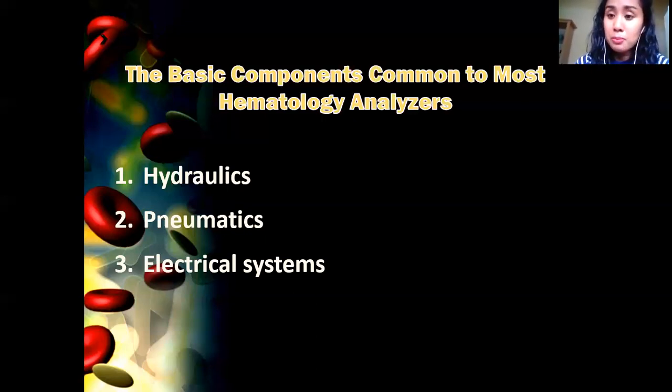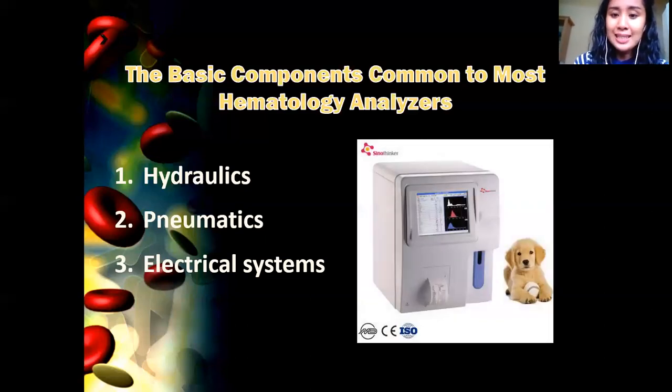So, as much as possible you have to know the tubes, ganyan, or you have to know kung may bara, ganyan, so that you can clean it out, mga ganun. So, class, your analyzer can be as small as this. Can be a size of 2 puppies. Ganyan. So, nakuha nitong image na to attention ko kasi may puppy, ganyan. Ang weird kasi ba't may puppy? But I think this is just to say that the analyzer can be as small as this one. Ganyan. Pwedeng tabletop.